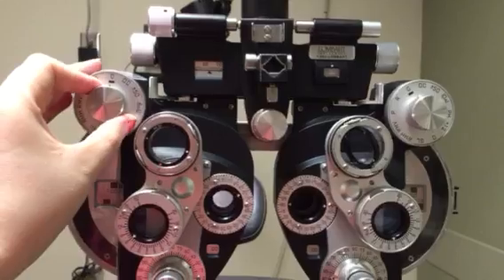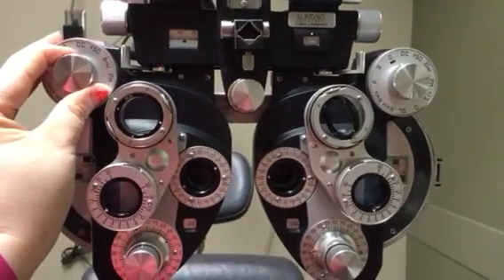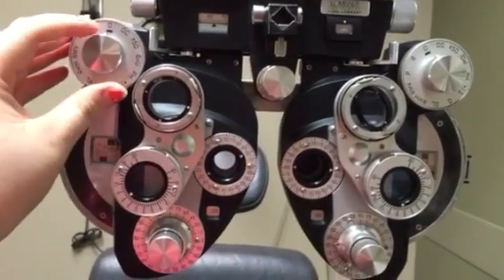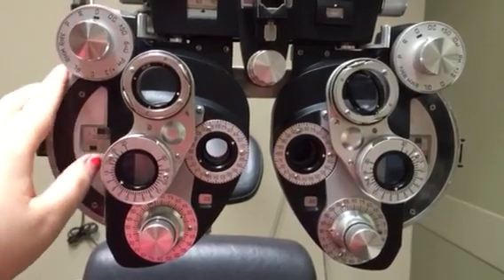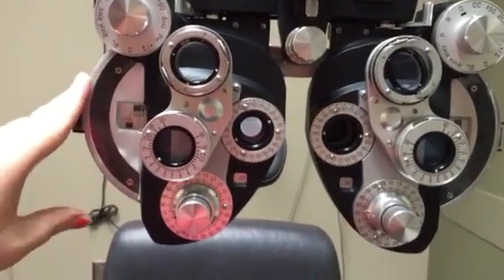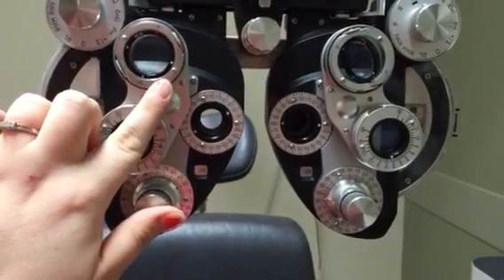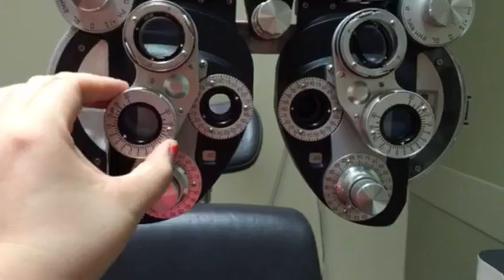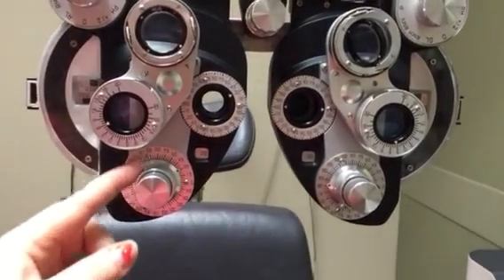You also have this knob here — this is to open, marked with the underline, and to close, marked with the OC. You'll use primarily these two notches on this machine. This larger wheel is your sphere. Then you have your Jackson cross — this whole unit — and this is for prism.